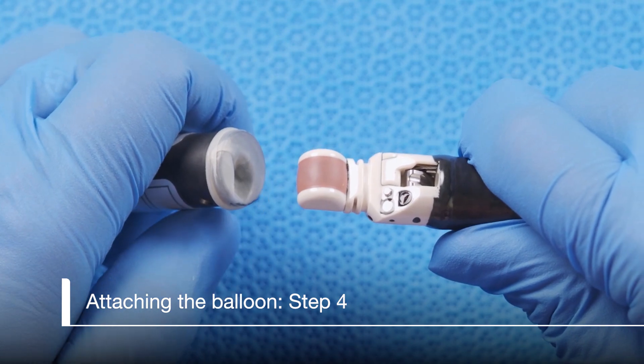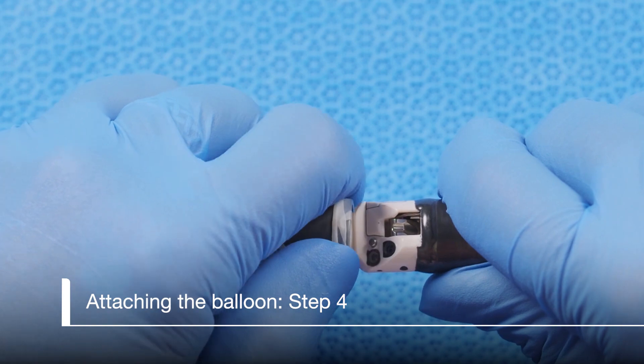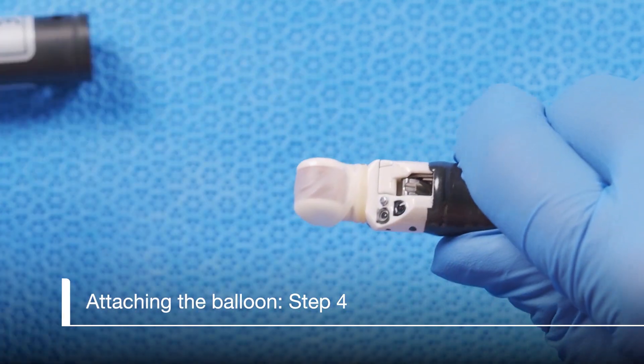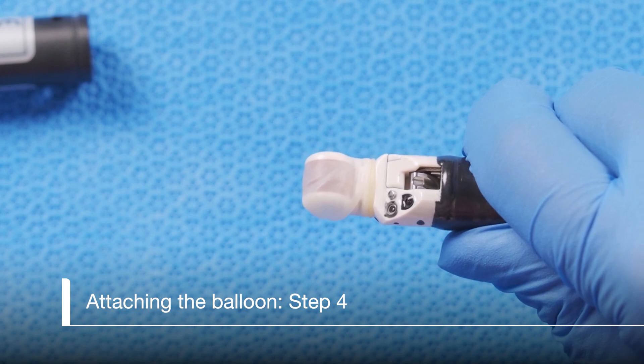Using the applicator, place the balloon over the scope up to the groove. Using your finger or thumb, roll the ring off of the applicator into the groove. Remove the applicator. Take care not to rub the balloon between the applicator and the scope as this can sometimes rub a hole in the balloon.